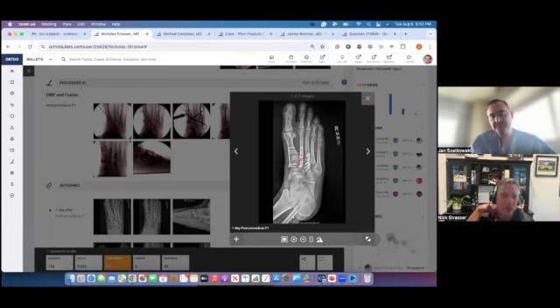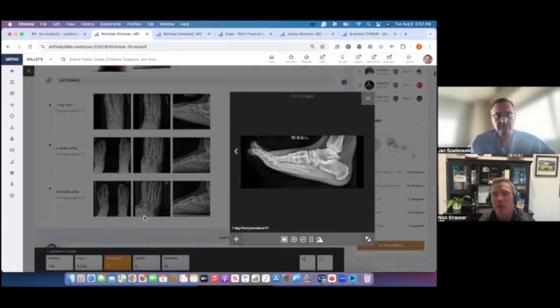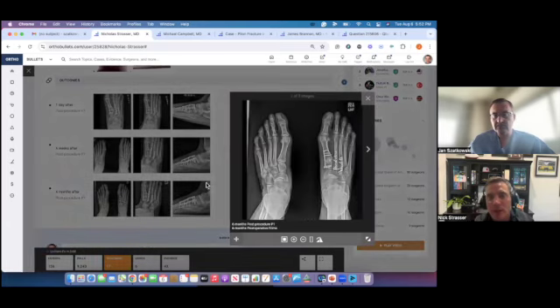When I do a fusion, I'm probably less aggressive with fixing across the Lisfranc joint because, and maybe there's an opportunity for intercuneiform instability here, but I kind of feel like if the first and second and third are fused and stable, it's probably going to be okay across the intercuneiform joints. The other thing I will do, and I didn't do it here, is that on that medial plate on the first, that usually is medial enough that I can run screws across the intercuneiform space as well, and I'd run it all through that plate. And then I feel like I can stabilize that entire construct.